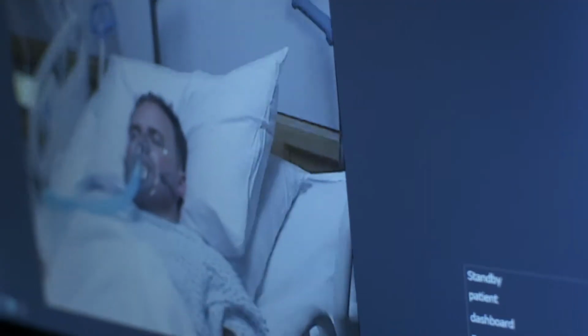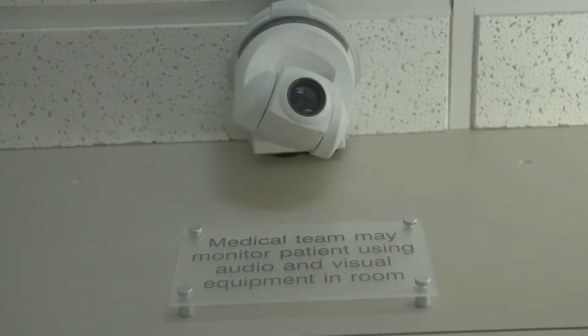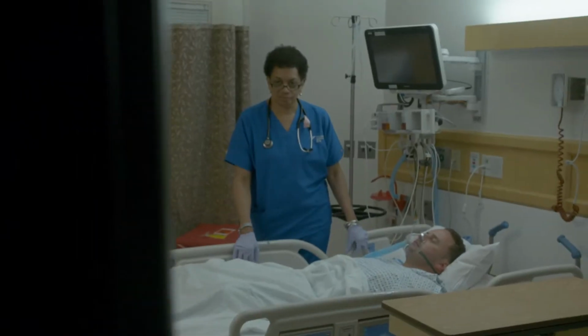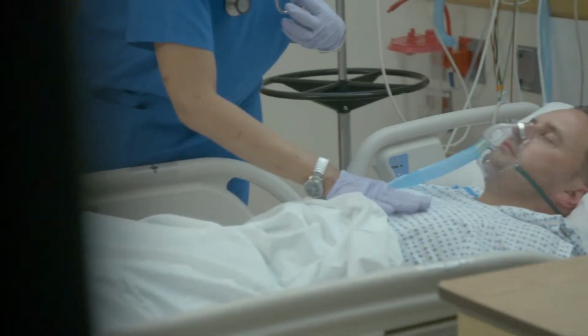Yeah, and he doesn't look like he's breathing real well, so can you call respiratory therapy to the bedside? If we could grab the ambu bag and assist him with ventilation until respiratory gets his ventilator. Diana, great job. The ICU doctor's on their way, and we'll continue monitoring until he arrives.